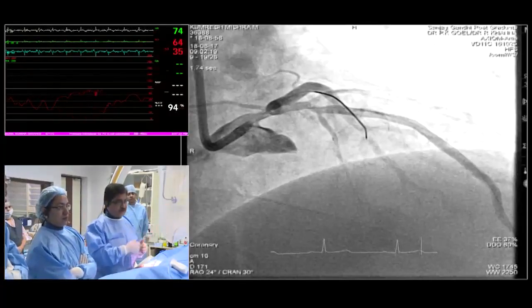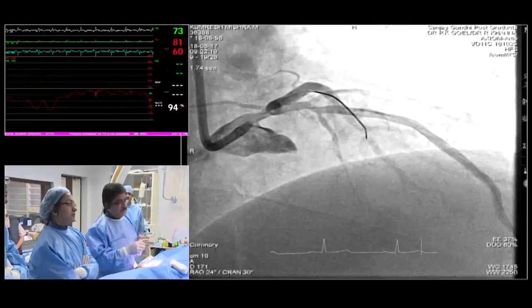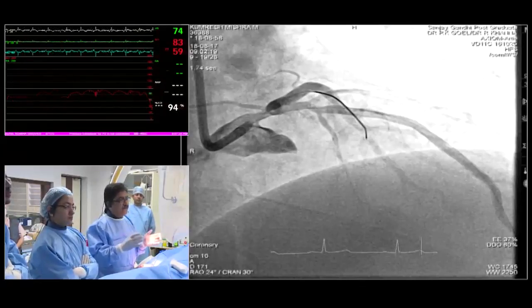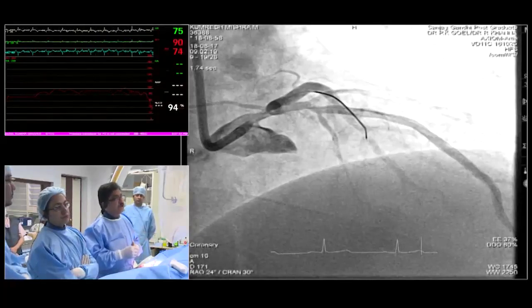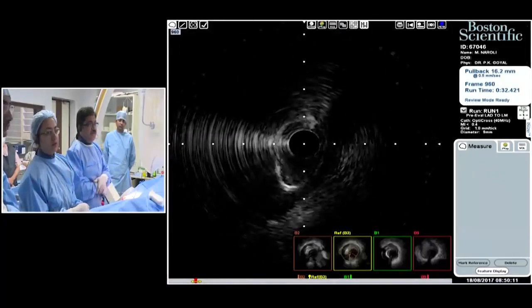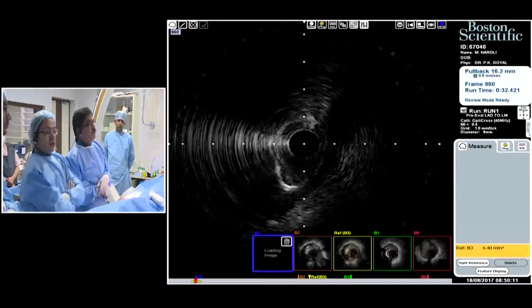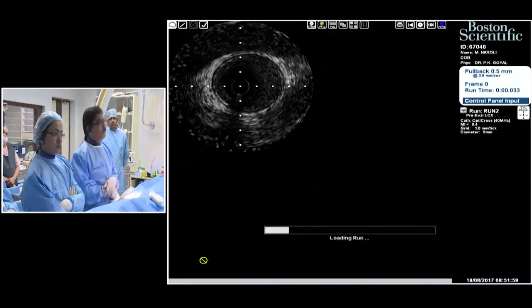Now, if I want to avoid the circumflex stent and plan for a provisional stenting, in a case like this you can do it because the circumflex was open. Can we have an LM ostium stent, if it's okay with you, LM ostium from IVUS, left main to LAD, and then we'll decide on the size of the stent. Is that okay? If the LCX is free from disease, I think you can do crossover stenting.